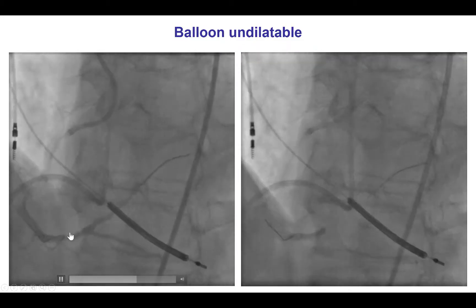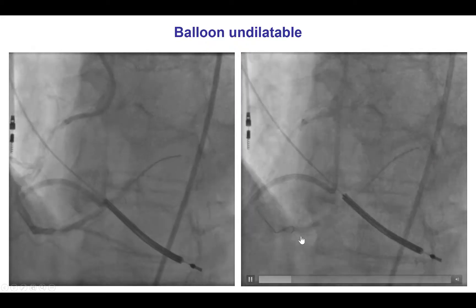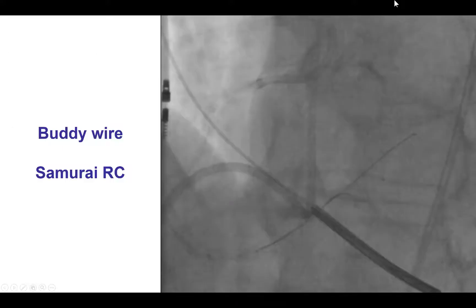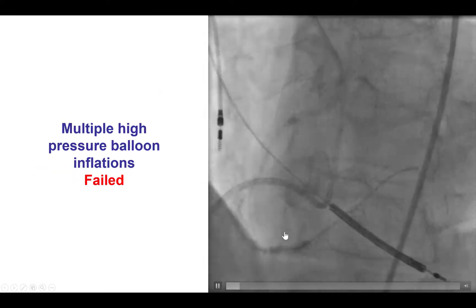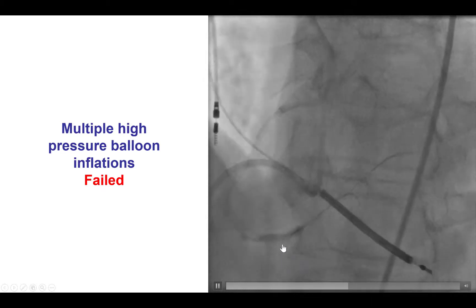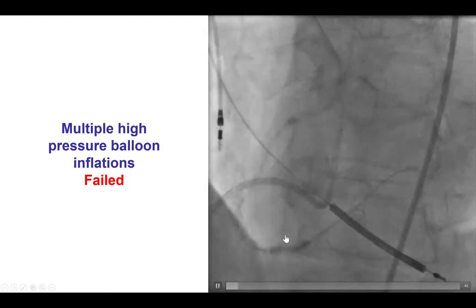We advanced the balloon to the distal RCA, but unfortunately we found that the lesion was balloon undilatable with a persistent waist in the balloon. One way to deal with this is to use one or more buddy wires in an attempt to modify the lesion. So we advanced a Samurai RC wire next to the initial wire, and then performed more high-pressure balloon inflations, but unfortunately, despite going close to 30 atmospheres, we were unable to dilate the lesion.